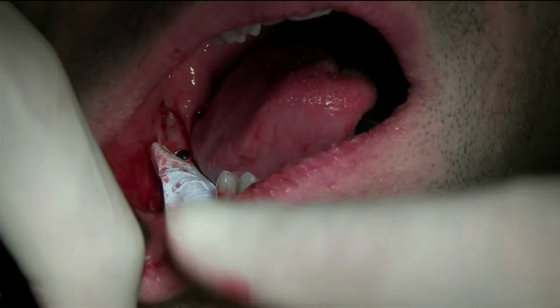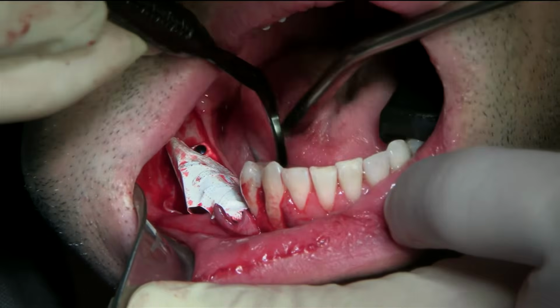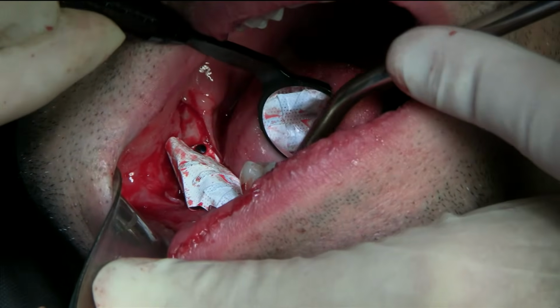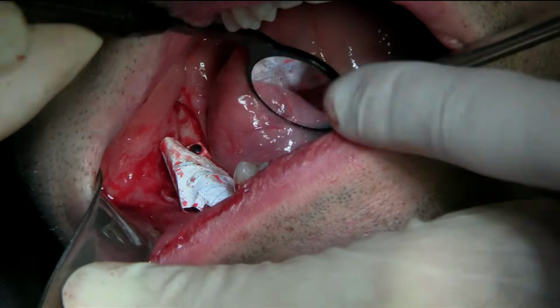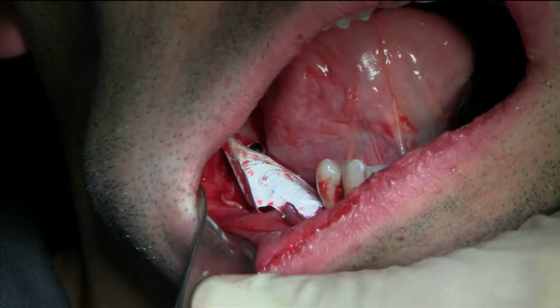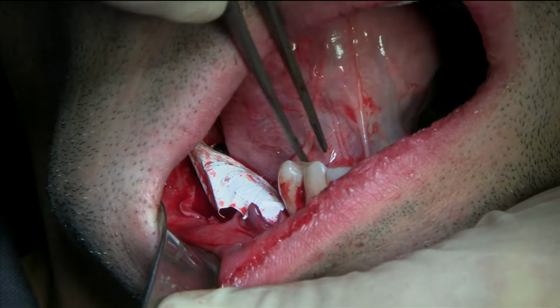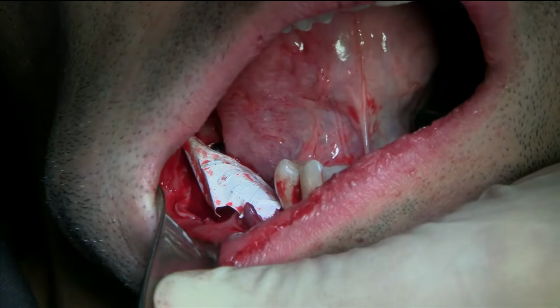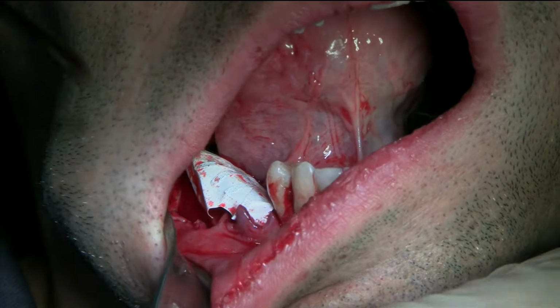Okay, so the screw's in, but I don't know exactly where it is. Just hold this one here.